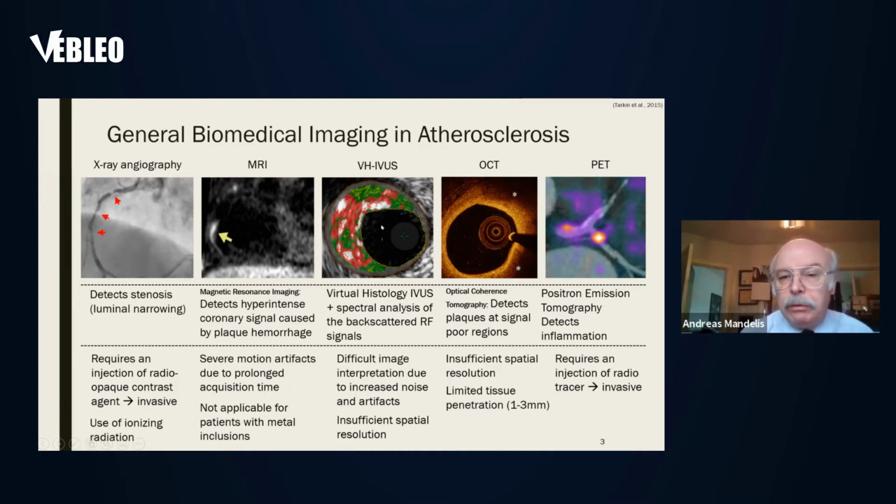It's reflected off surfaces that have different density and speed of sound. So as a result, it does not have a high degree of contrast. So, and the resolution, of course, is something that is not all that great with it. However, it has high penetration depth, and that's something that we should keep in mind.